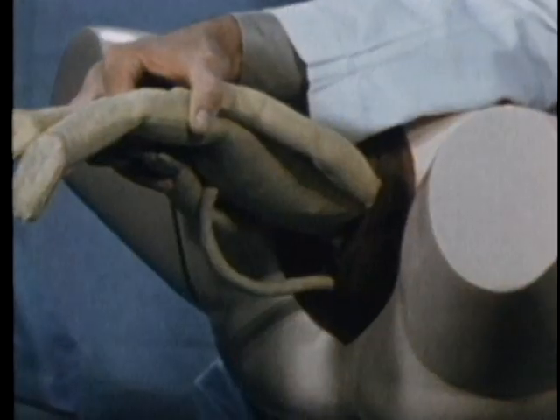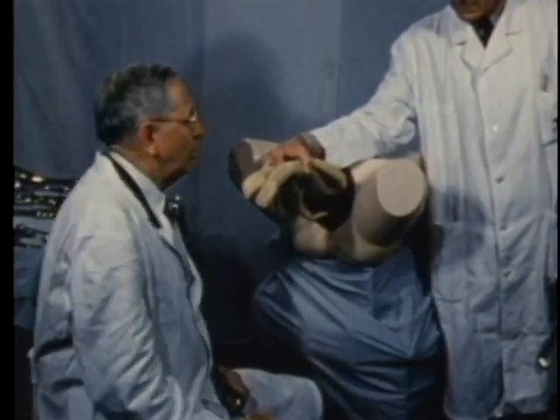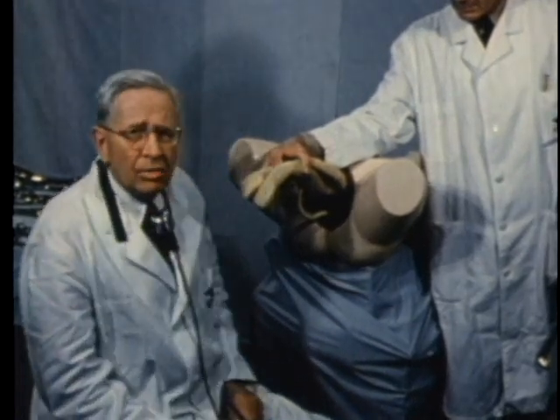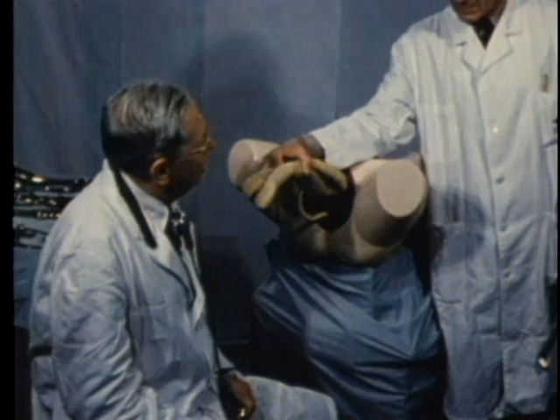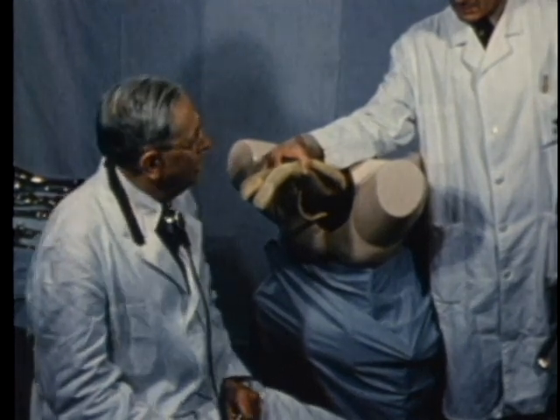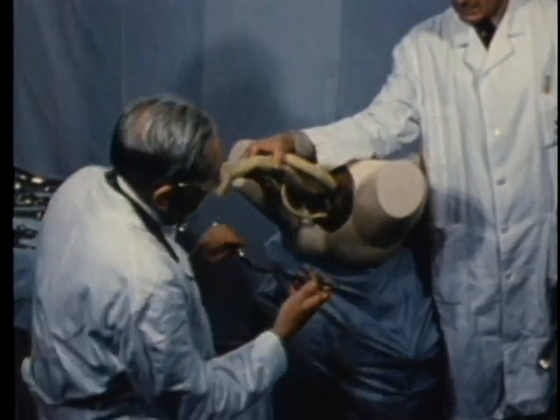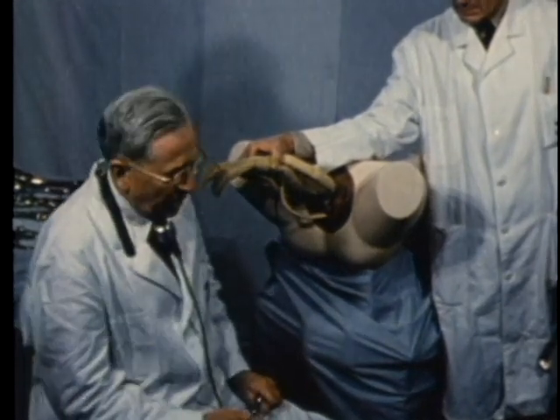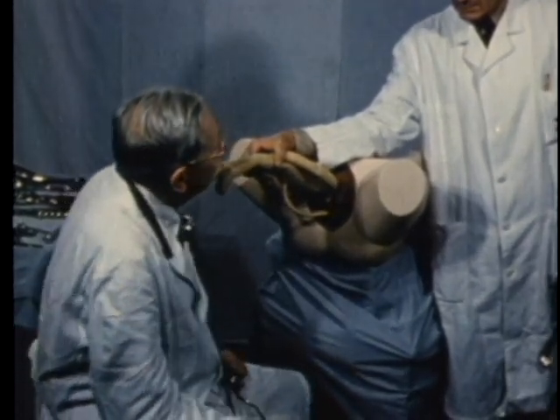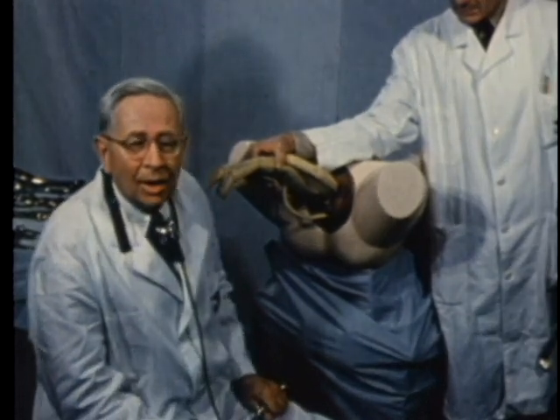Now for the technique. After the breech, the body, and the arms have been delivered and the head has been brought into the pelvis by the Smellie-Mauriceau maneuvers, if there is any resistance to progress, the Piper forceps are applied to avoid the possibility of injury due to traction on the body or pressure on the aftercoming head. The operator assumes the sitting position. Piper advised the kneeling position and stated that when confronted with a situation of this gravity, it is advisable to adopt the attitude of prayer.